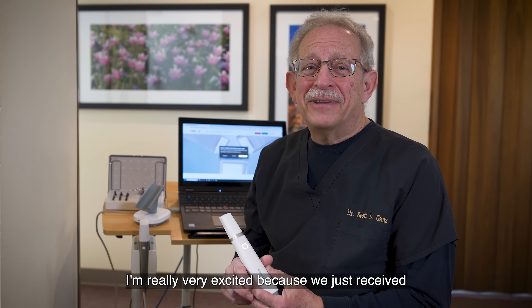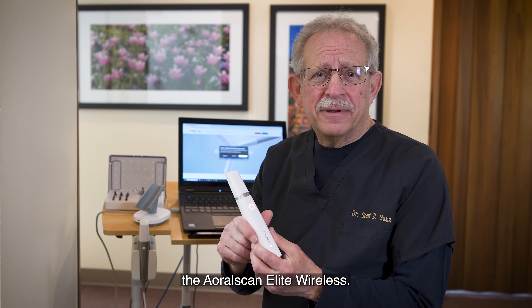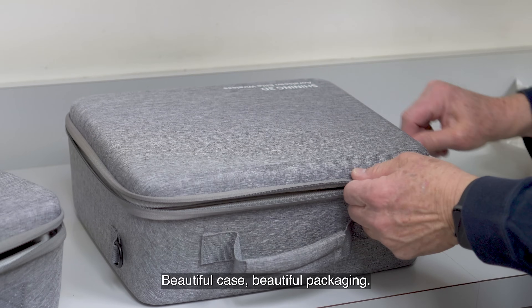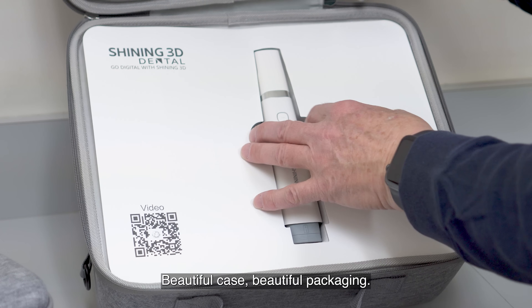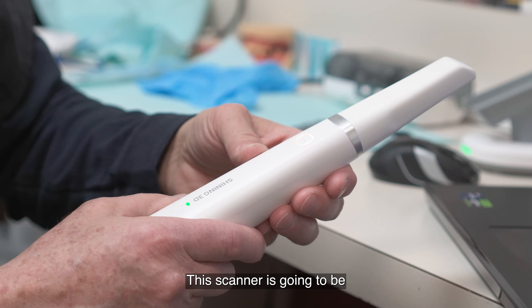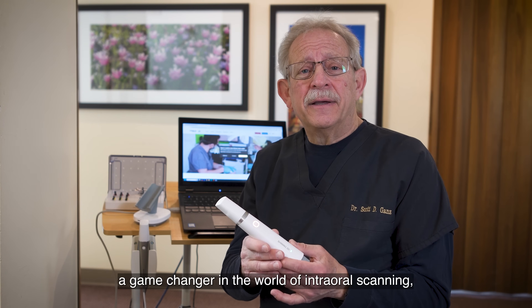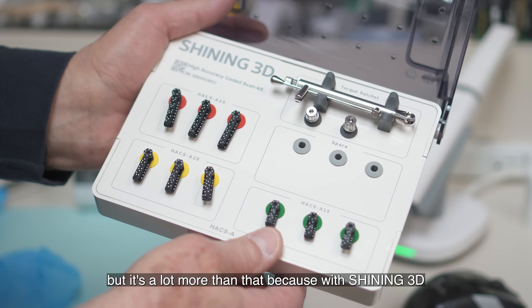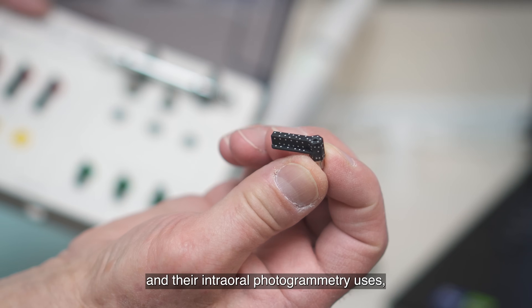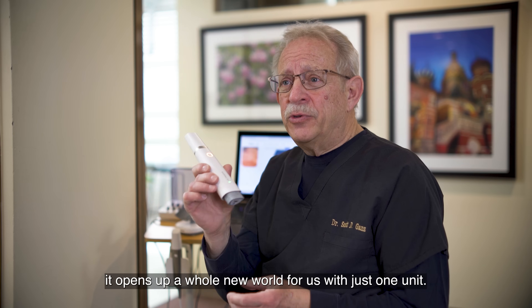I'm really very excited because we just received the Aoral Scan Elite Wireless — amazing product. First impression: beautiful case, beautiful packaging, everything is right where you would expect it. This scanner is going to be a game-changer in the world of intraoral scanning, but it's a lot more than that, because with Shining 3D and their intraoral photogrammetry, it opens up a whole new world with just one unit.